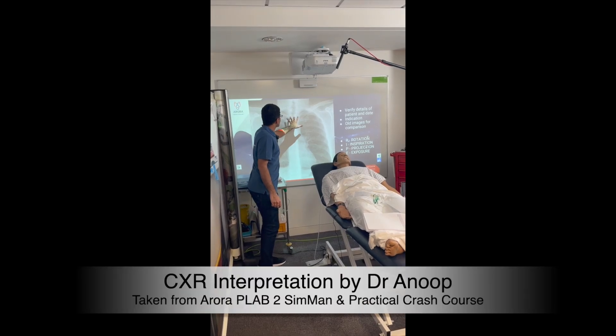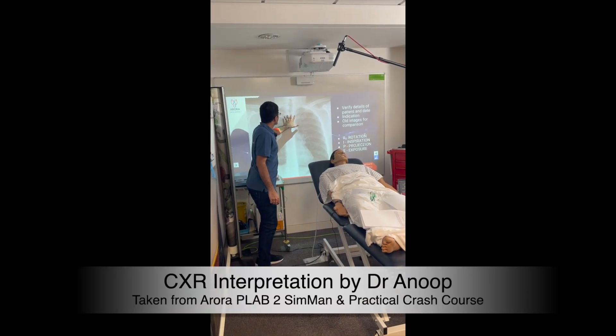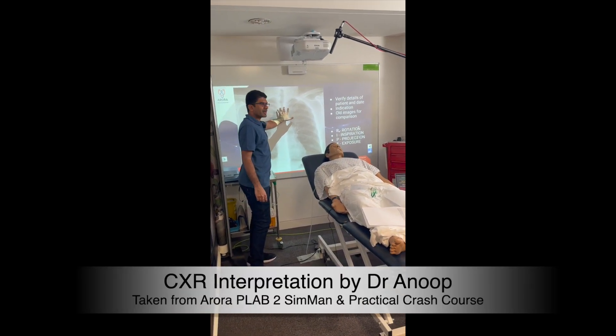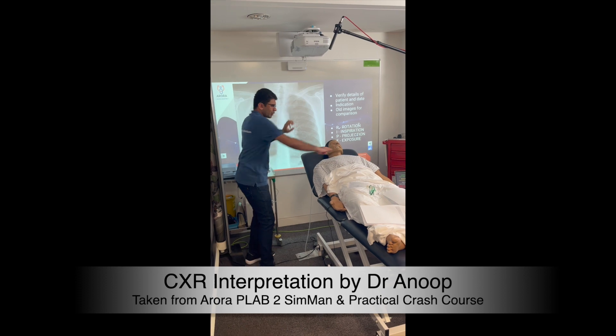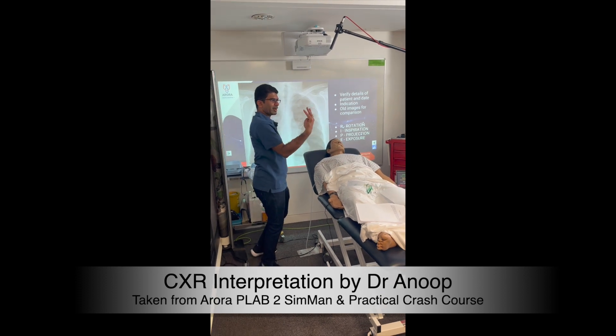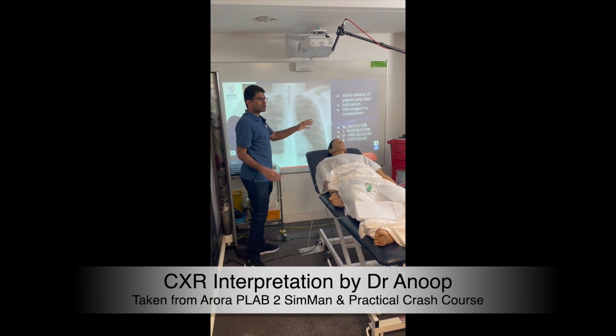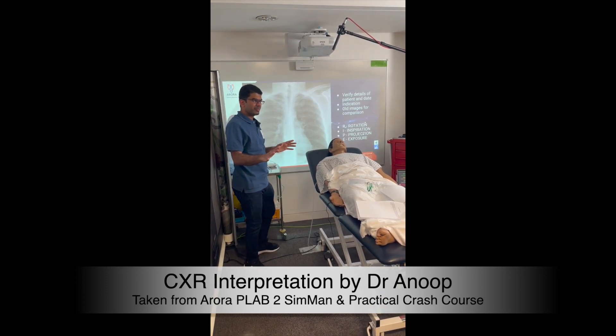This is the spinous process. The spinous process should be equidistant from the medial end of the clavicles, like your trachea midline. If it is, then the film is not much rotated.